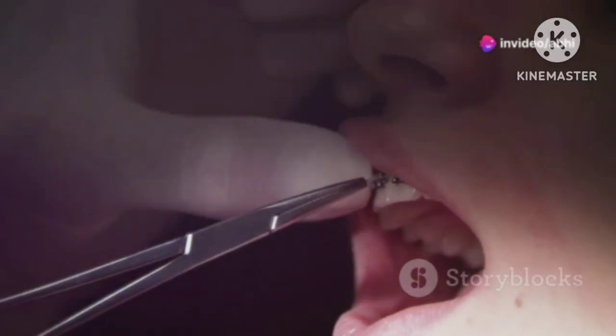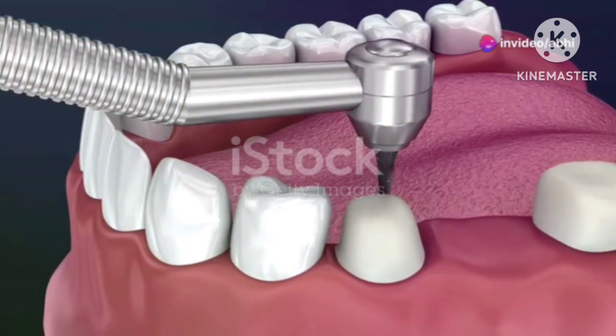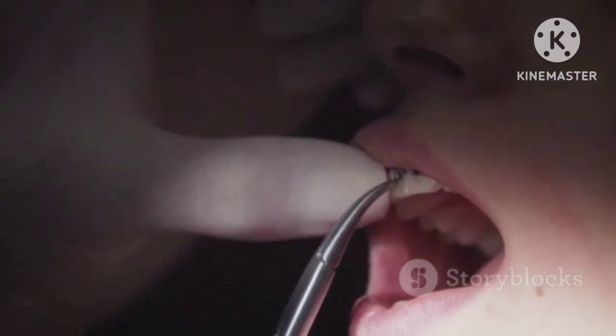Next, a thin wire is placed around the teeth to create a support system. The wire acts like a mini bridge, holding those wobbly teeth steady. This helps in stabilizing the teeth while your gums heal and get stronger.